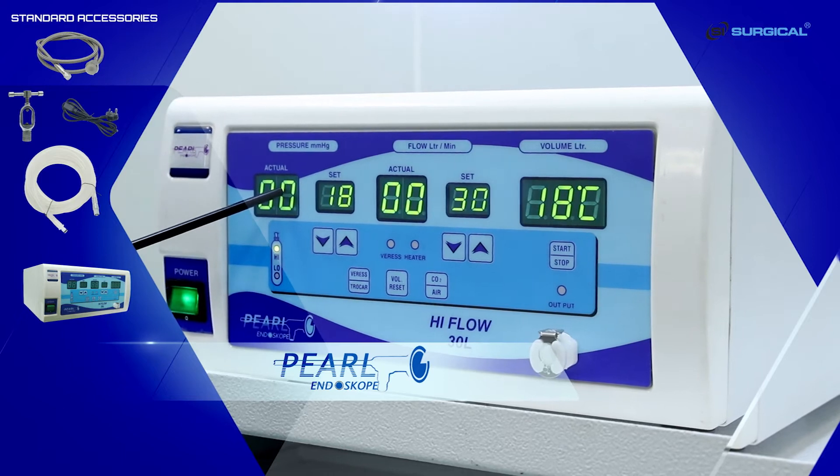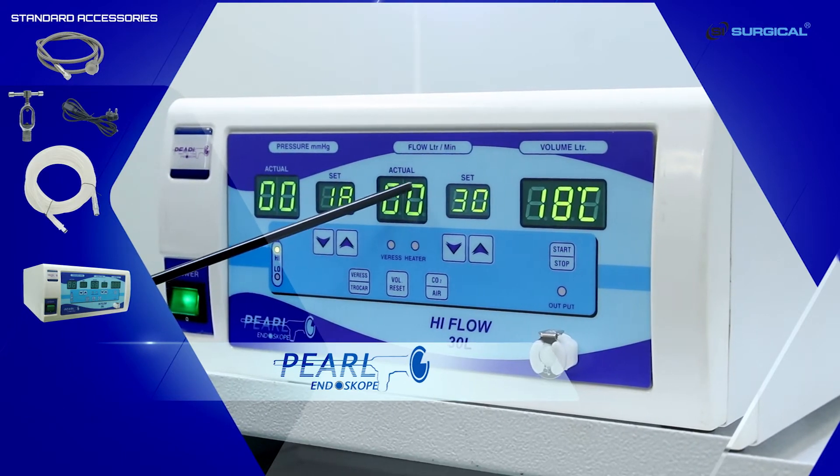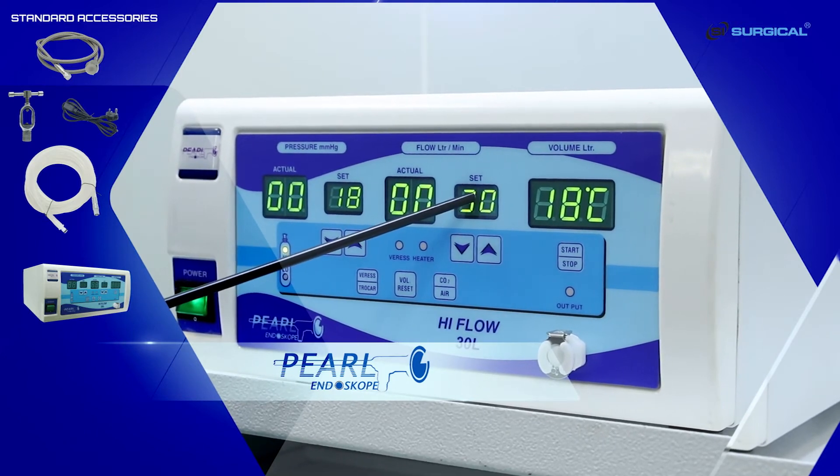This is the flow. Here too we have displays for actual flow and set flow. This is the lower key and the upper key for the set flow.